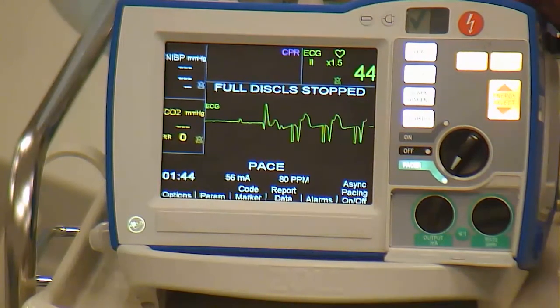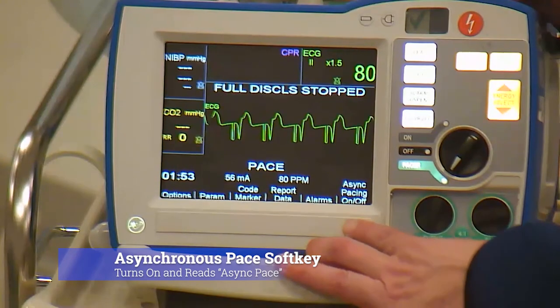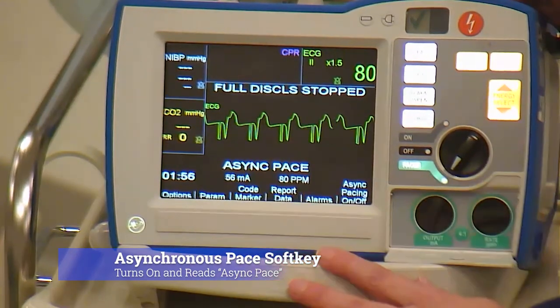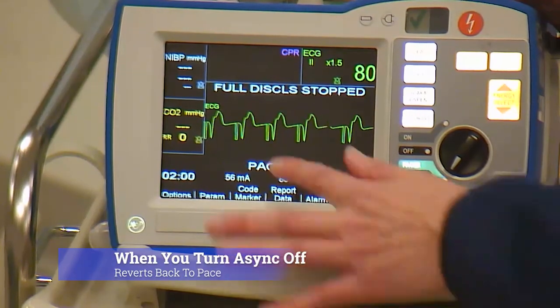As soon as you let go of that button, it will revert back to your previous settings. If you would like to asynchronous pace, just turn it on and it will say asynchronous pace. Once you hit the soft key again, it will just go back to pace.